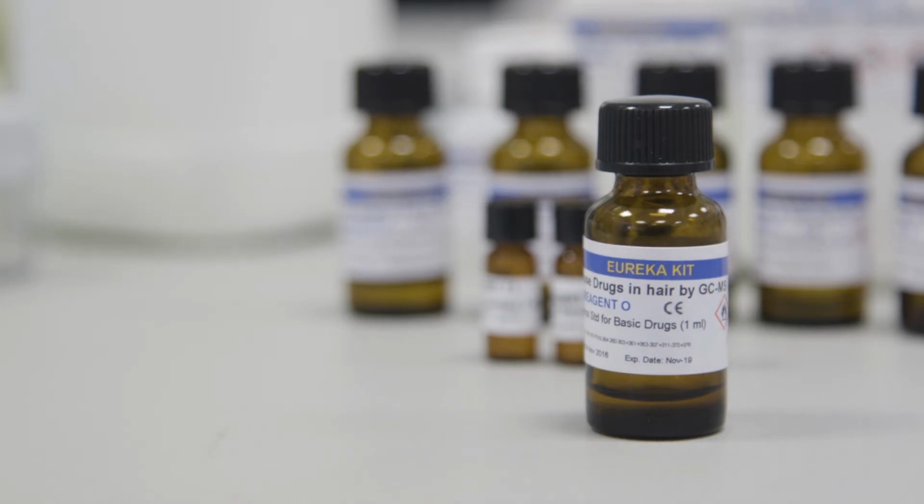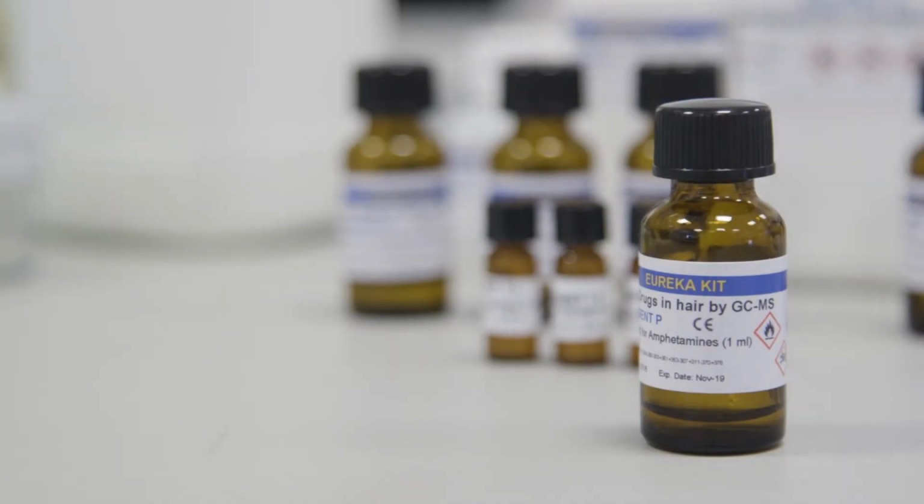At this point, we need to start preparing the internal standards. For the entire run, the reagent O, internal standard solution for basic drugs, and reagent P, internal standard solution for amphetamines supplied in the kit, must be diluted 1 to 10 with water before each use. You have to prepare sufficient volume for the entire analytical session.